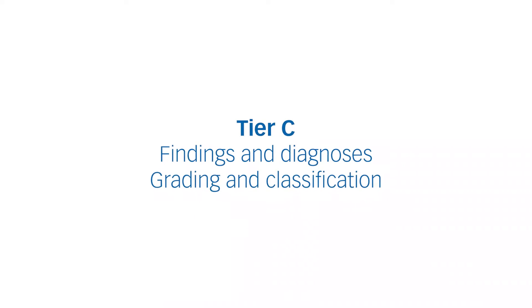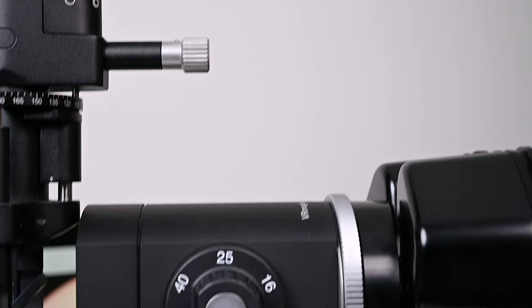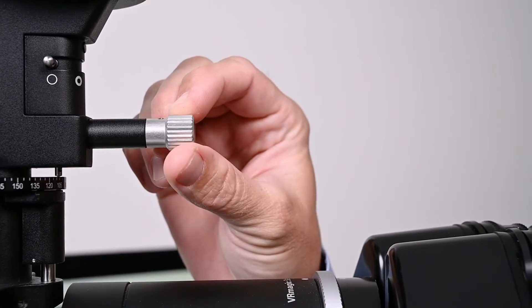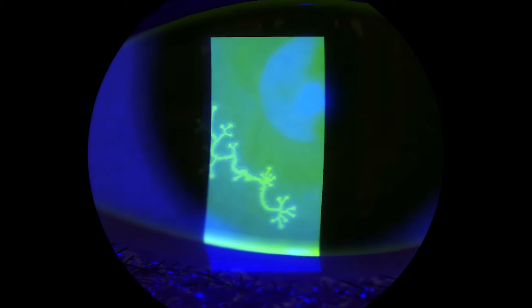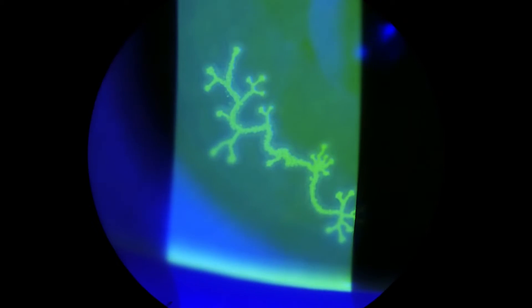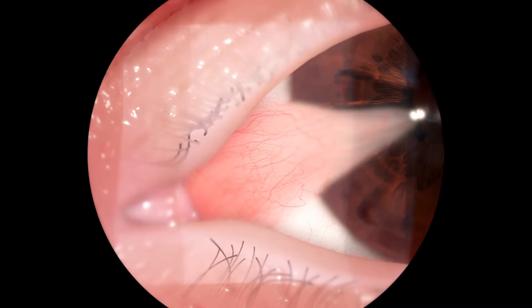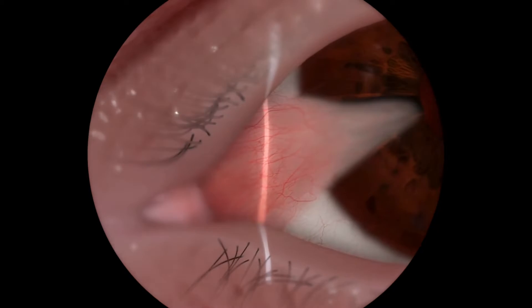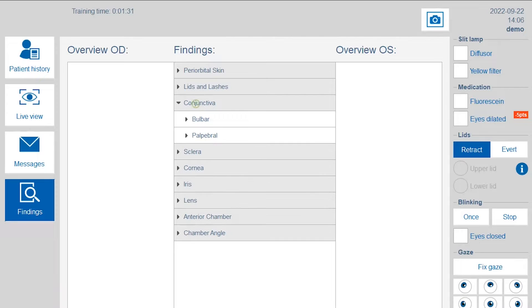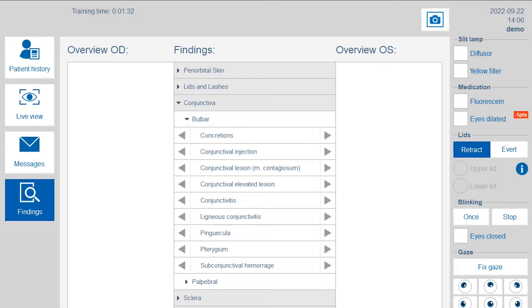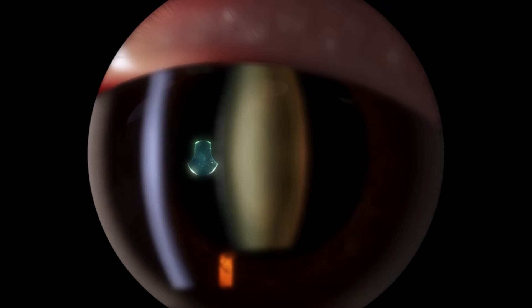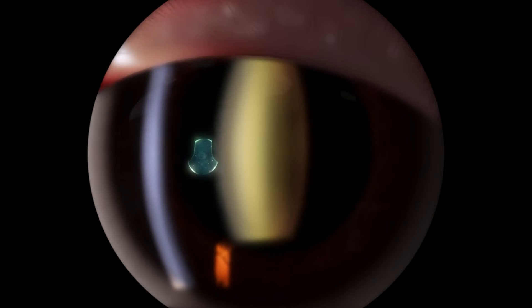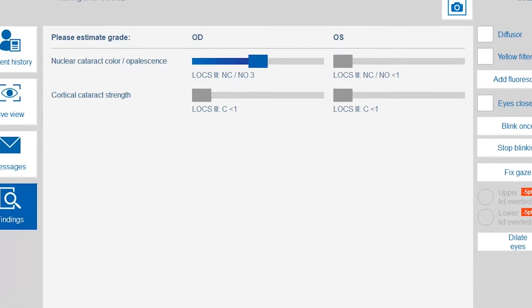In Tier C of the iSee Slitlamp courseware, trainees are introduced to common pathologies of the anterior and posterior segments of the eye. They learn to identify pathological signs and to make correct diagnoses. Trainees can study pathologies in different stages and get acquainted with grading and classification systems.